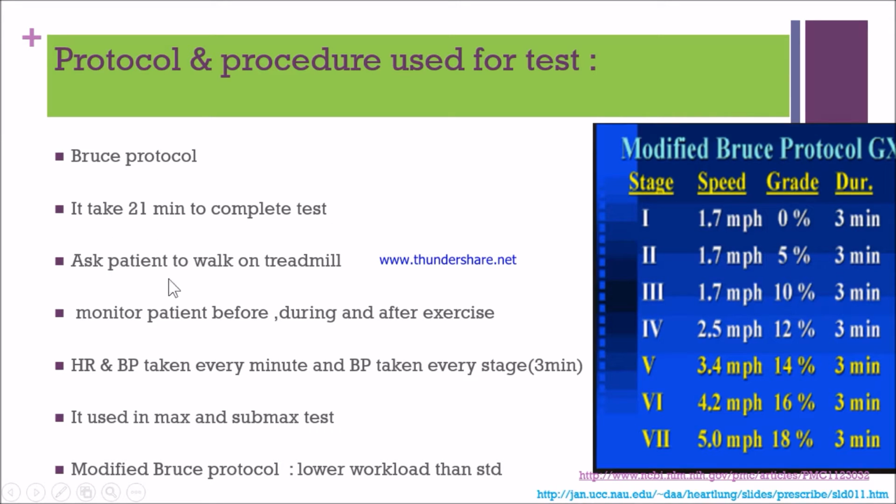We need to ask the patient to walk on the treadmill. While the patient is walking on the treadmill, we need to monitor the patient before, during and after the exercise. We need to monitor the heart rate and the blood pressure. We need to take the heart rate every minute. Blood pressure is taken every 3 minutes. So every stage, 3 minutes, we need to take the BP.